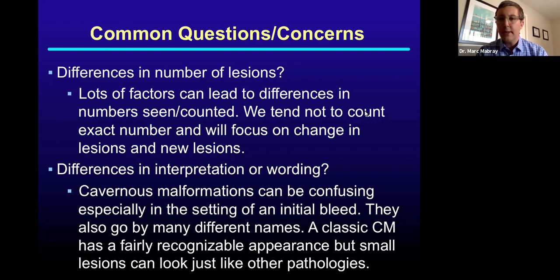We tend not to count the exact number or put that in reports on follow-up imaging. And on follow-up imaging, we will focus on change in lesions, in new lesions as being the most important things. Differences in interpretation or wording. So cavernous malformations can be confusing, especially as I mentioned in the setting of an initial bleed.